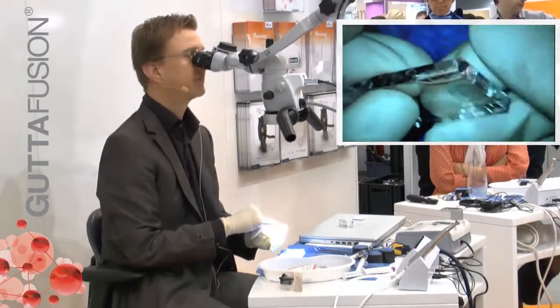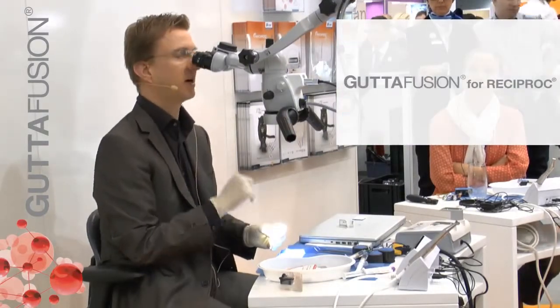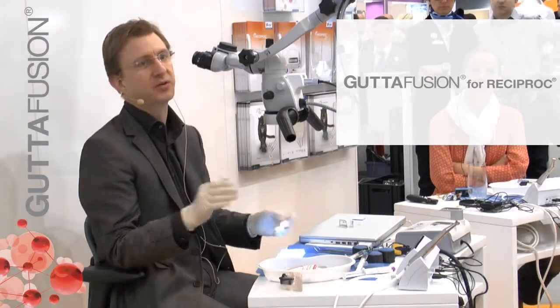carrier. And I would continue to clean the cavity of the gutta-percha and then place a post-endodontic restoration.